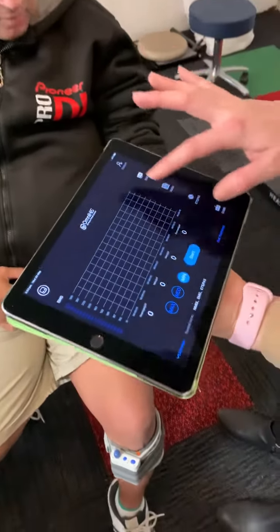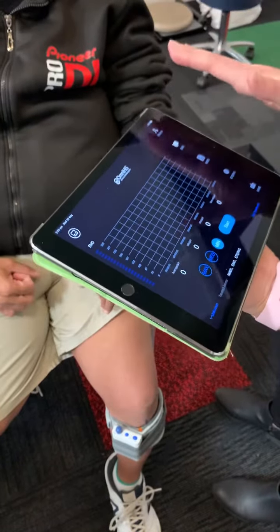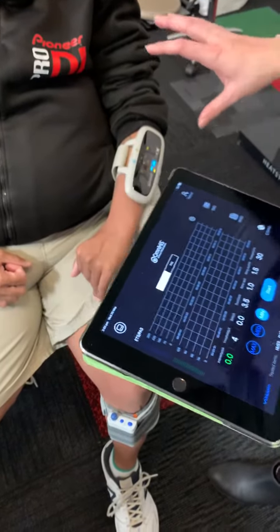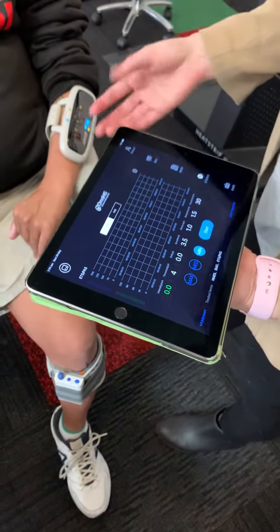We had just measured Junior's EMG signal, which is what Junior's muscles can actually produce, and we got to 13 as our maximum EMG signal. So we're just going into the area where now we're trying to change the program where Junior is going to use his muscles to fire and trigger the stim.